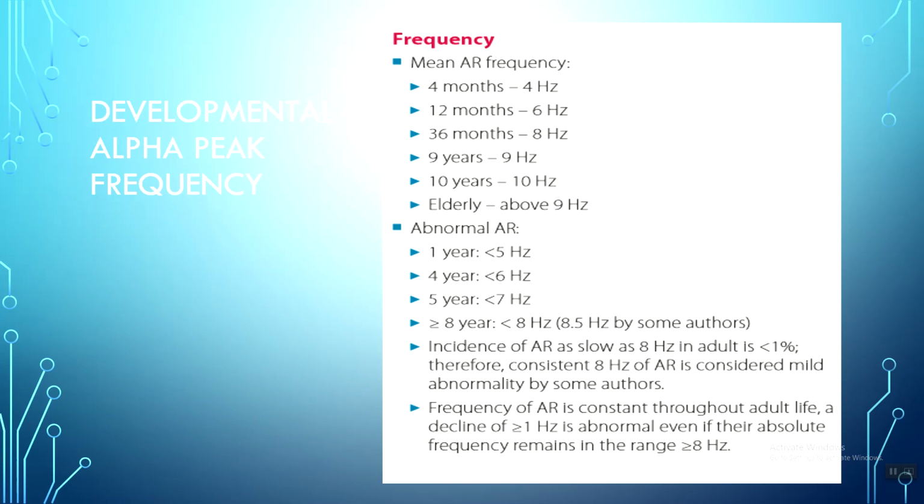This is totally a good slide to take a picture of, and let me explain what this is saying. As we get older, from the time that we're born until we're roughly 10 years old, but honestly 10 to 15, especially for boys, who are later than girls, our alpha peak frequency speeds up. When we are 4 months old, our alpha peak is a 4. That's our processing rate, the gating rhythm of the thalamus. That is alpha, even though it's in the delta range.